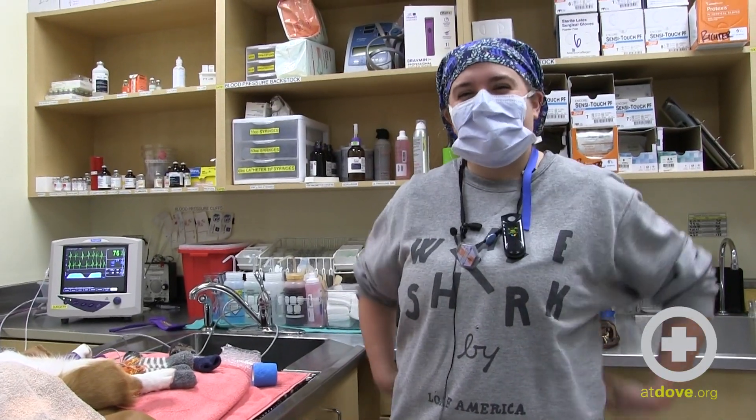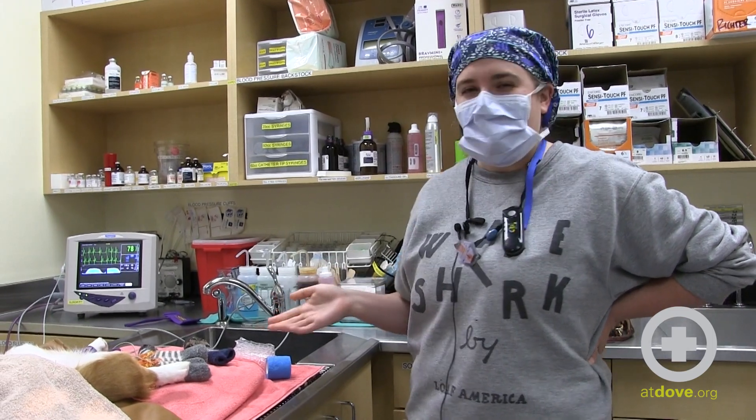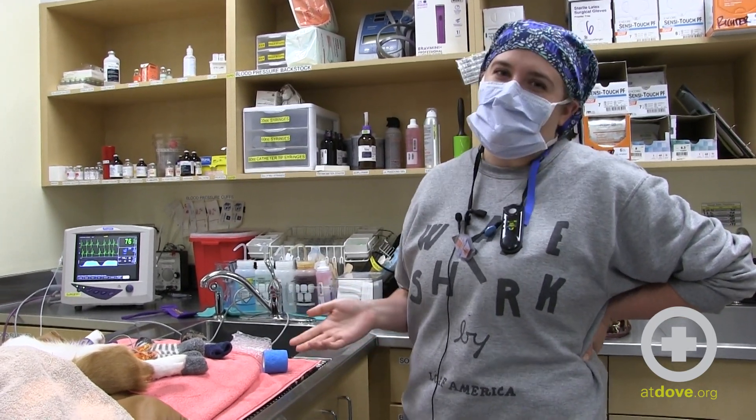Hi, my name is Katie. I'm one of the surgery assistants here at Dove Lewis. I'm going to teach you how to properly wrap the feet of your patients so that they stay nice and warm during anesthesia.